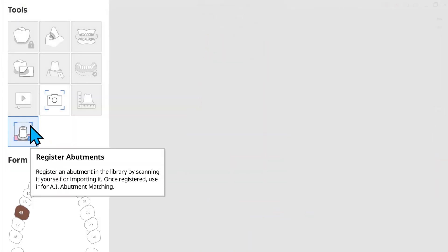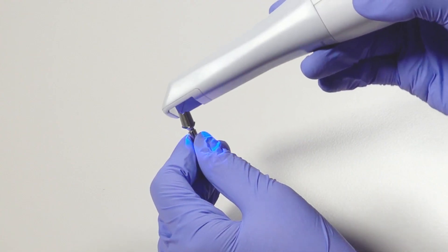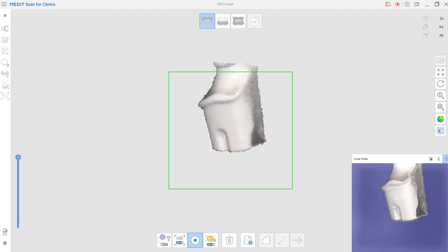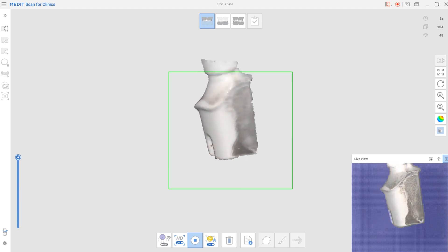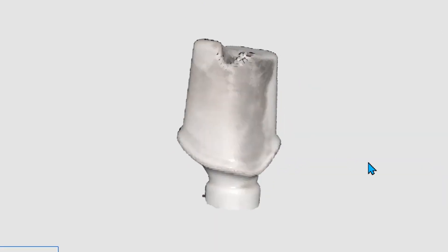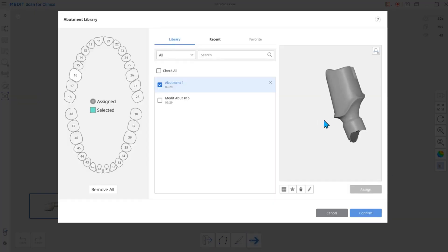You can use the register abutment feature to scan the abutment using the intraoral scanner and register it as a library. After registering the library, you can align it to the scan data.